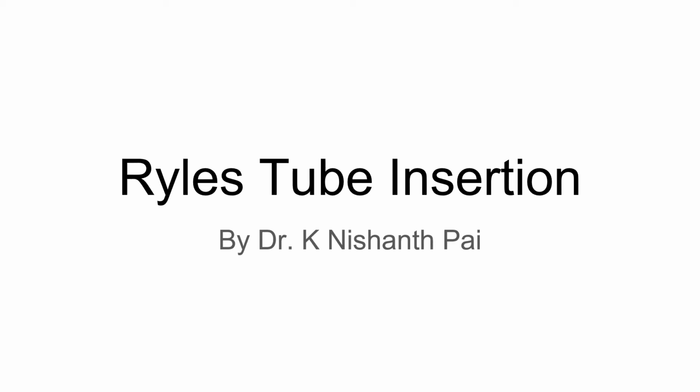Hello everyone. Today we'll discuss Ryles tube insertion. It is also called a nasogastric tube. This particular tube is inserted from the nose into the stomach, so this is also called Ryles tube insertion.